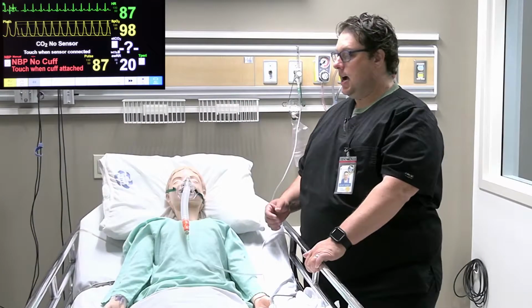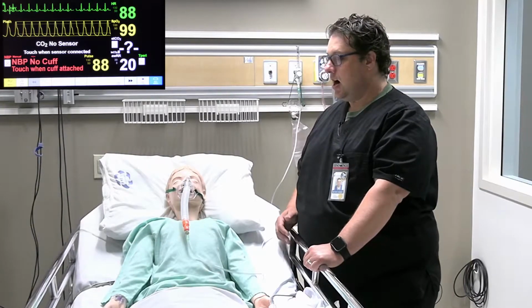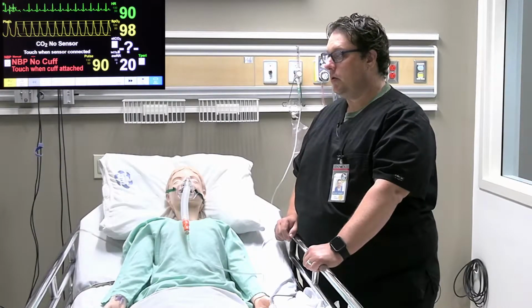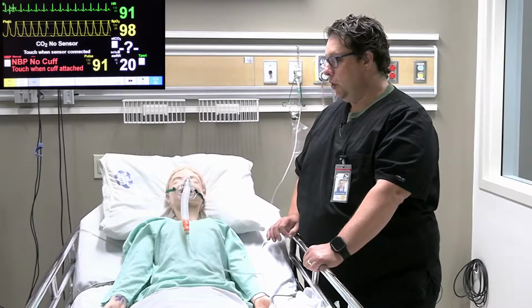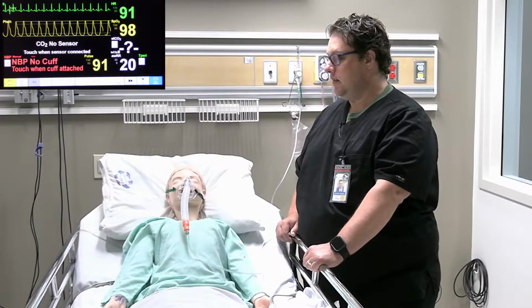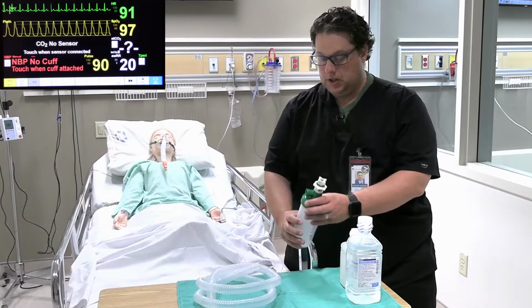So here we are with our patient now on 50% via the Venti-Mask. As you can see on the screen here, the vitals are quite stable. Child is no longer in respiratory distress. So for long-term therapy, it's probably not ideal to leave them on the Venti piece. So let's have you consider switching to a large volume nebulizer to provide some cool mist humidity to the patient to make the gas more conditioned and more comfortable. So I'm going to go through the setup of the large volume nebulizer.